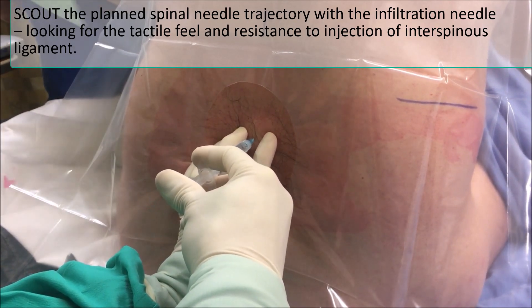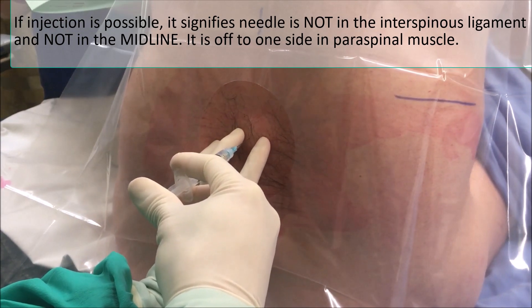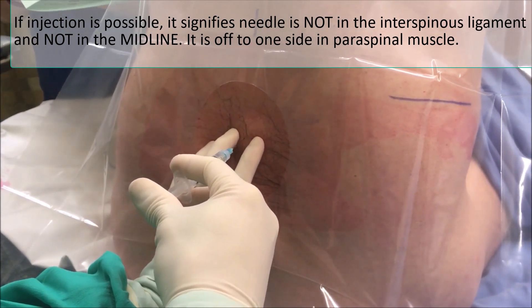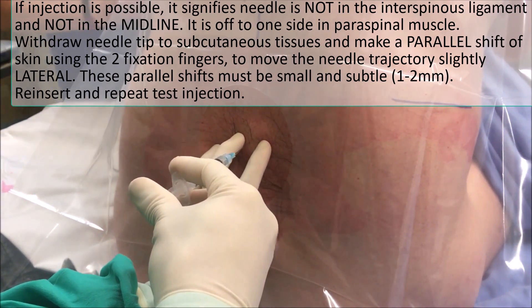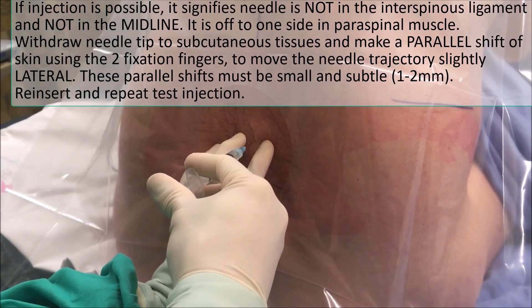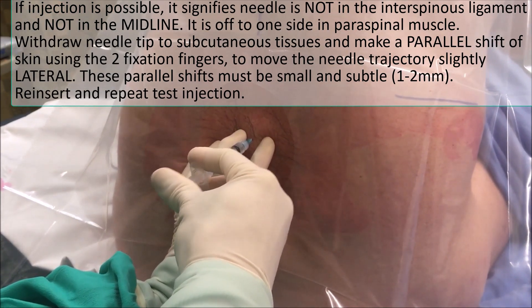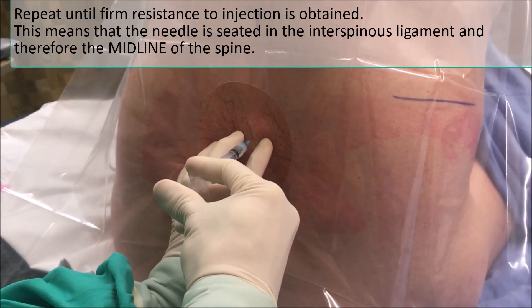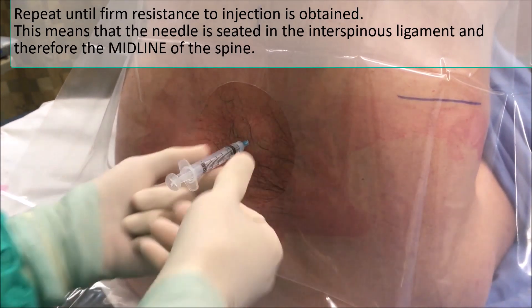Now I'm going to see if I can find the ligament. I can inject, so now I have to come back to the skin and shift the skin over left and go back in again — it's still injectable. Let's shift it to the right; feels a little bit more firm now, and now I cannot inject. So the true midline is a little bit to the right.